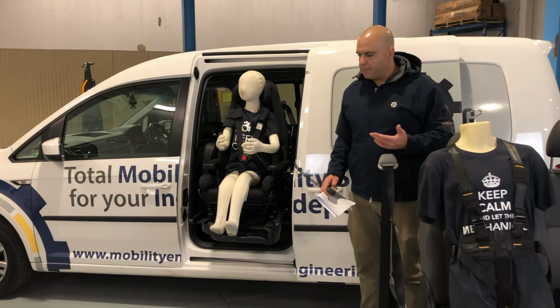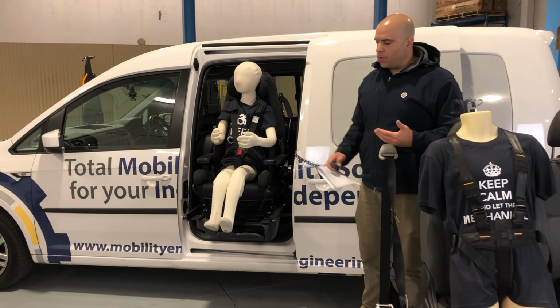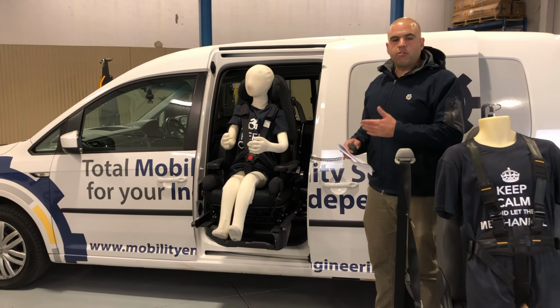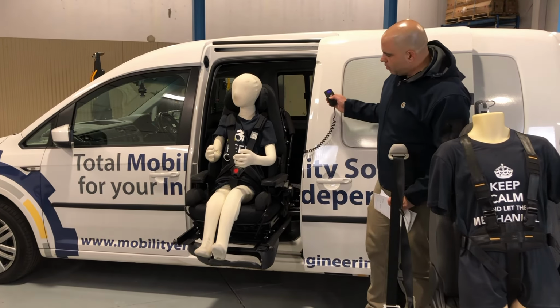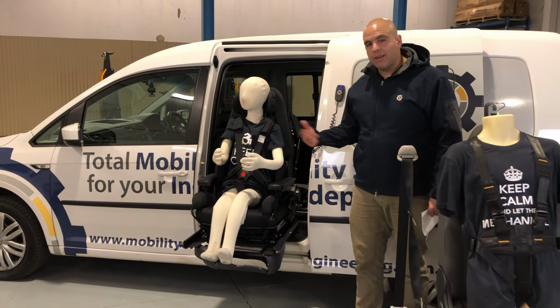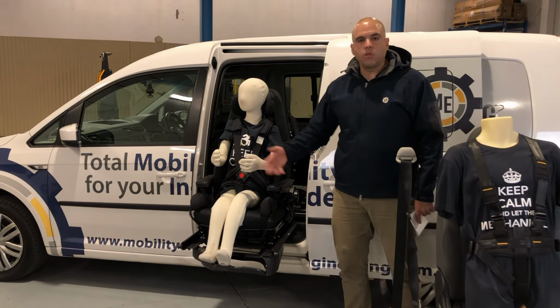way of seating. What you can also do, if the car is compatible with that, is change the seat in the rear to be a special pediatric transport seat. This seat here is the Auto Adapt GS seat. As you can see, this seat has got postural support, harness support, side postural support, neck support. You can actually add a lot more supports to this particular seat. It's a very customizable seat. You've got leg supports, and you can change all these supports in multiple different ways.